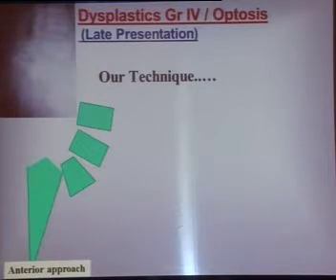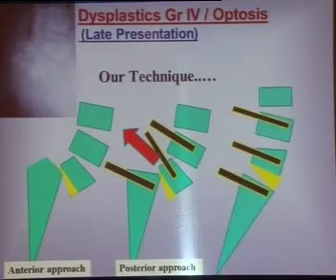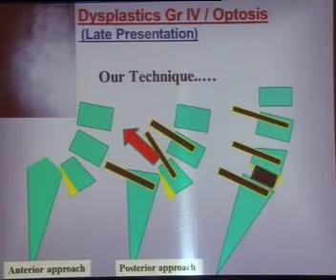Now, if you see the dome, which you see at S1, is easier to knock out from the back, but the wedge-shaped vertebra L5 you cannot knock out from the back, so it's easier to knock that out and release anteriorly. So we first go anteriorly and do a partial excision of the L5 wedged vertebra, and come back in the same sitting or a staged sitting, put the rods in, put our screws in L4, L5, S1, knock off the dome from the back, which is easier to do, and then gradually pull it back into position and do an interbody fusion of L5, S1.